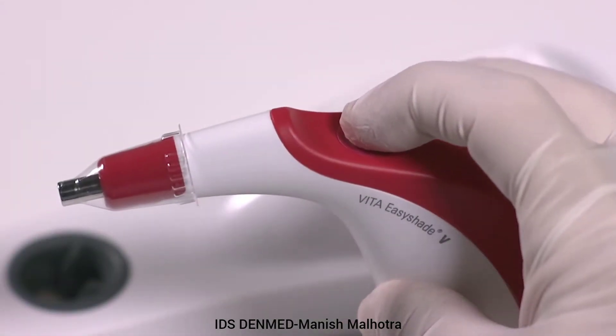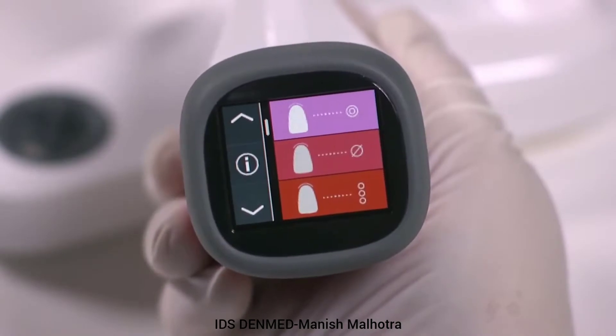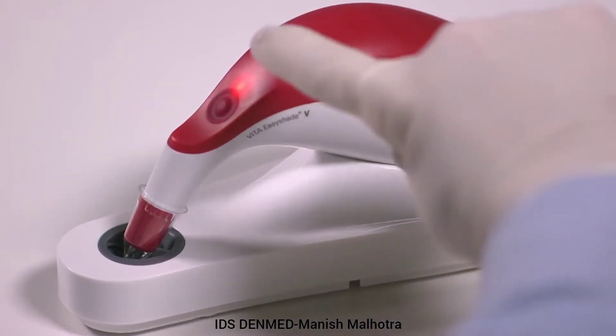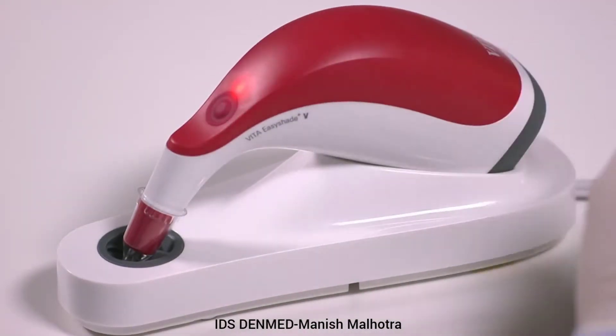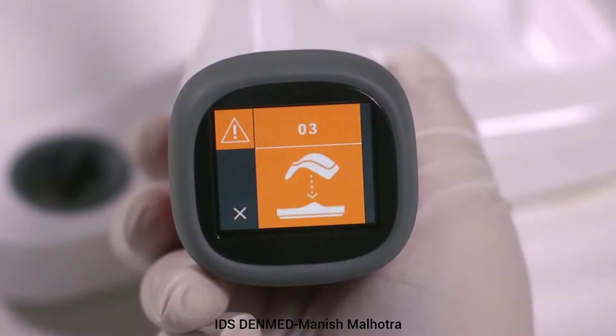Turn the device on by pressing the measurement button once. The default screen will appear. The unit must be calibrated prior to use. Seat the unit onto the charging base and push the measurement button once — the device will automatically calibrate. Make sure that you calibrate the device with the infection control shield on the unit. Calibrating without the infection control shield may result in unsuccessful calibration.